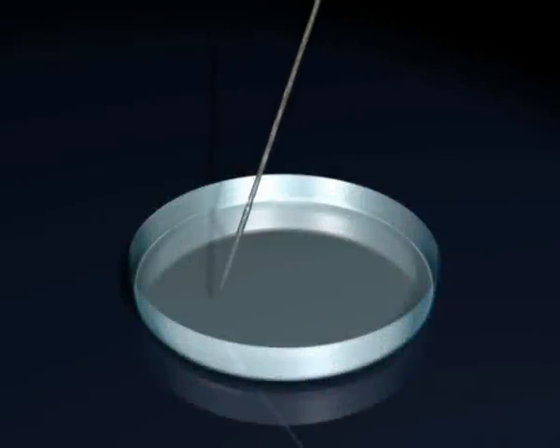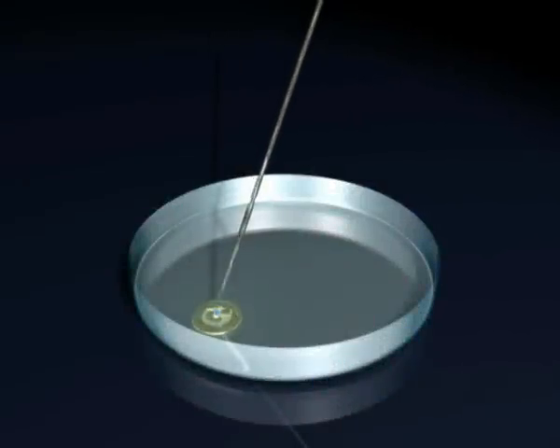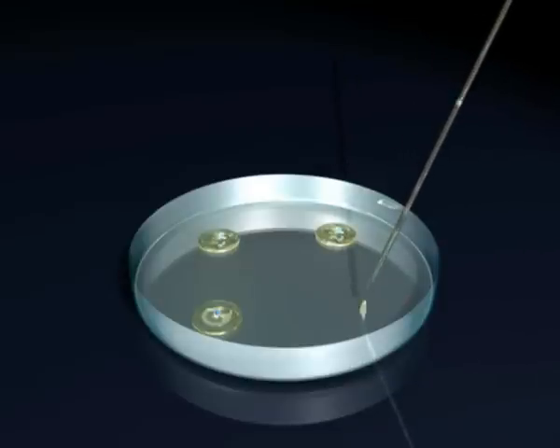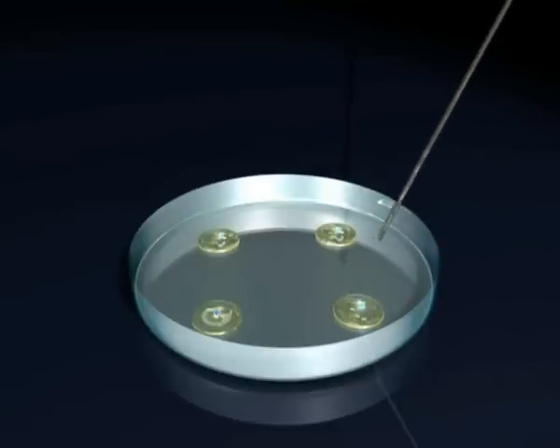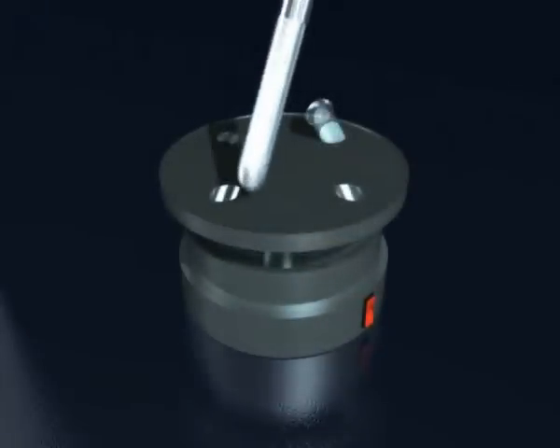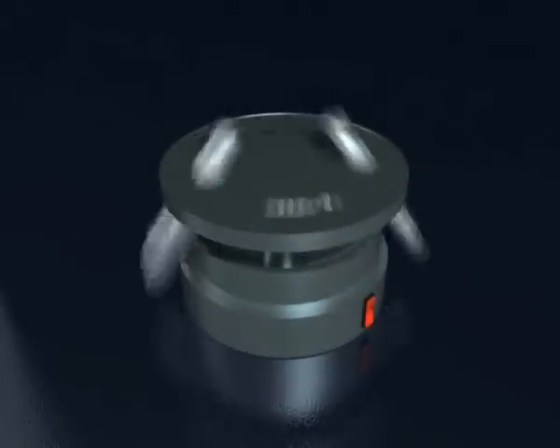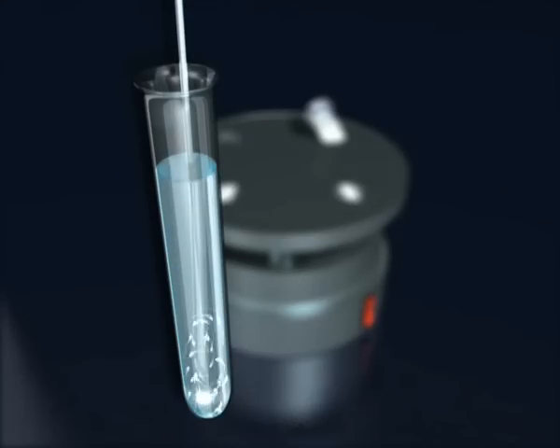Once the oocytes have been obtained, they are left in a culture medium distributed in four wells. Parallel to this, semen obtained through masturbation is prepared, separating the mobile from the immobile sperm and then concentrating them.